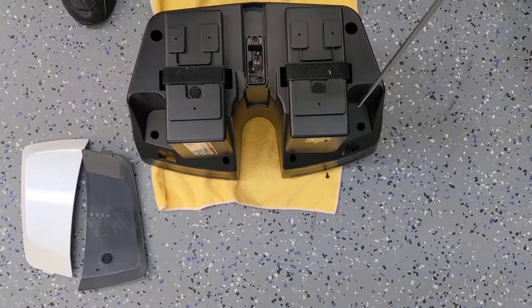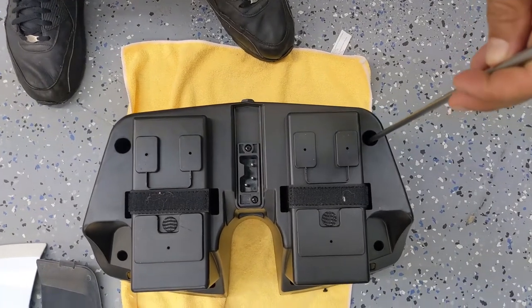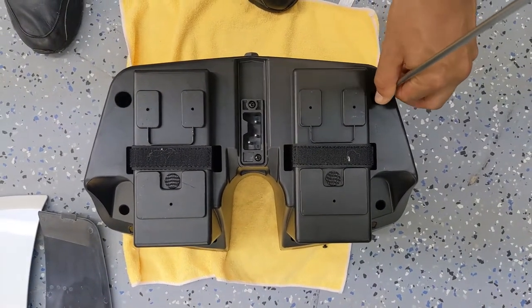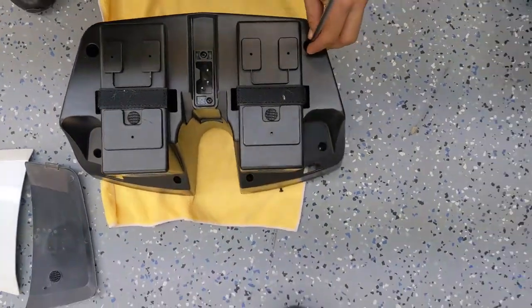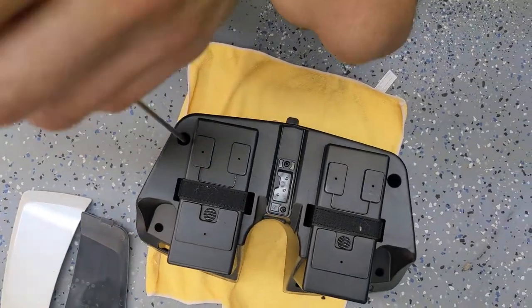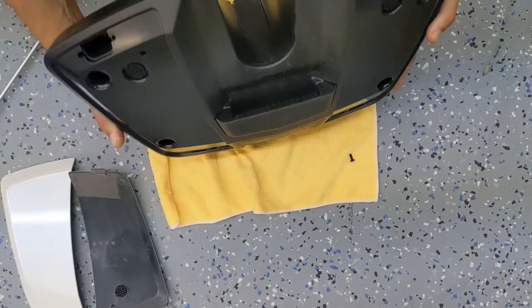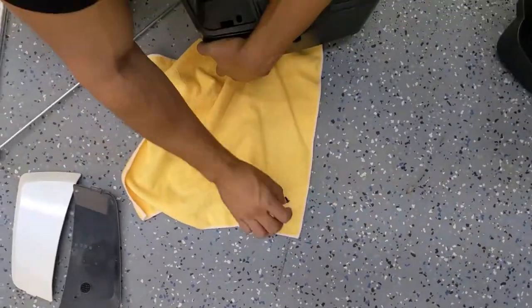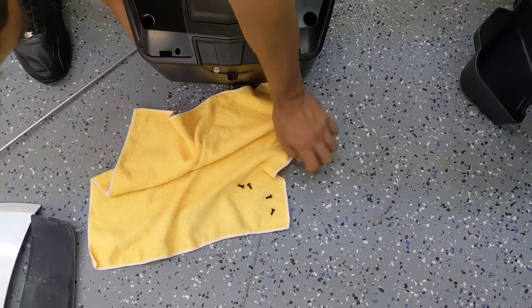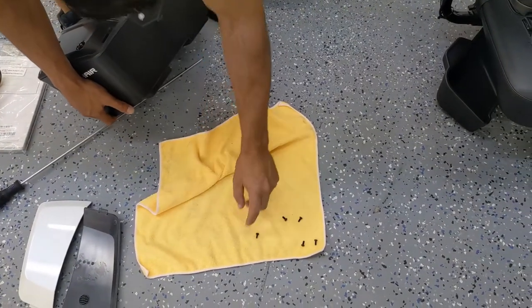Once you're done with the four screws in the front, look for an additional set of screws in the back. This travel case happens to only have six screws — some have eight — but either way, make sure you get all of the screws out. Now that we've got them all out, I'm going to flip it over and we should have six screws that fall out. And there's the sixth one, so all six are out.